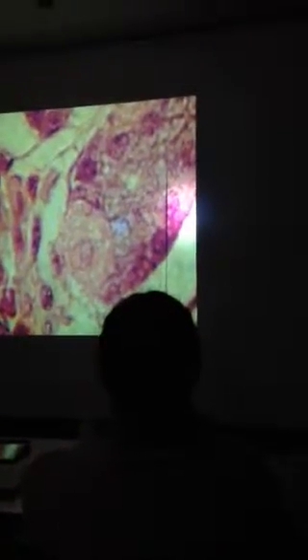All right. It's a little bit faded out, but what am I looking at here? Again, this is reality. This is what you get. Not in textbooks. This is what you get when you look under microscopes at slides that are provided by companies. This is a parietal cell right here. See the purple right here? See the purple up in here? This is one of those large parietal cells, okay?